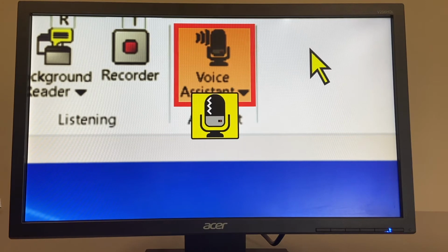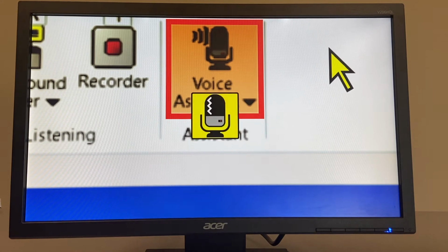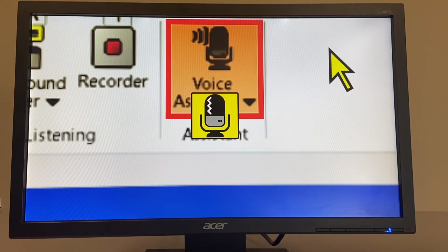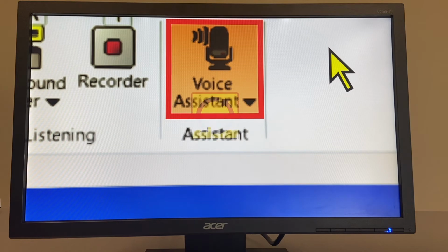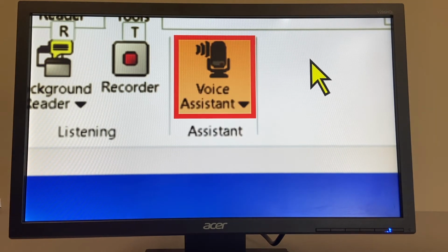Increase magnification. So you see it just increased the magnification. I can do it again. Decrease magnification. Invert brightness. Sorry, I didn't catch that. Okay, so as you can see, there's some work to be done there.